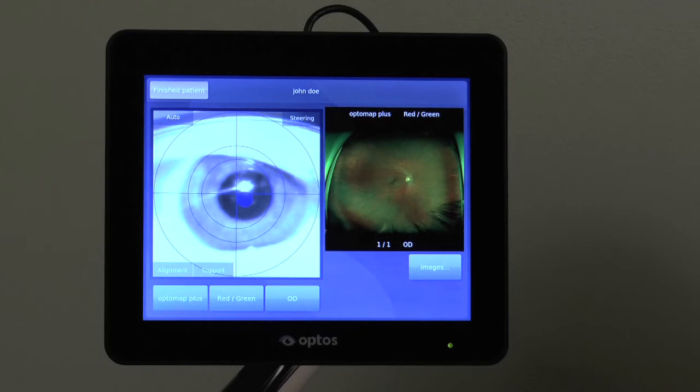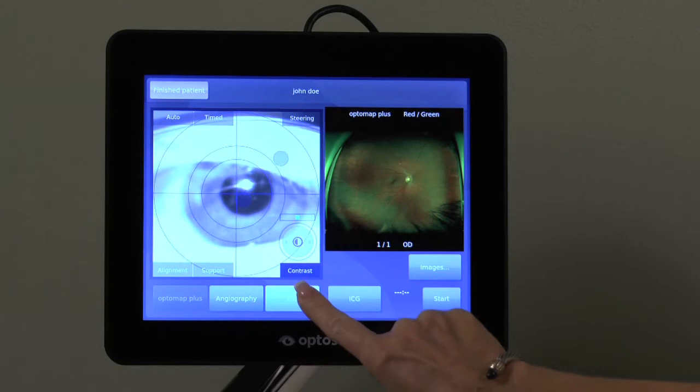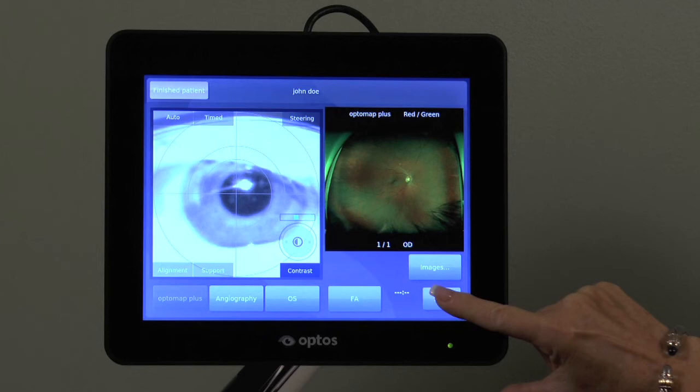If you are doing either an FA or ICG study on the patient, select angiography, the study eye, and the specific procedure being performed. You may start the timer by touching the start button or by depressing the capture button on the hand controller, with elapsed time displayed here.